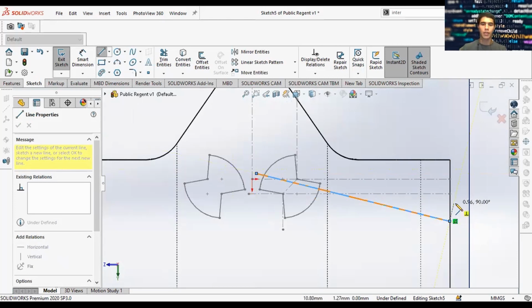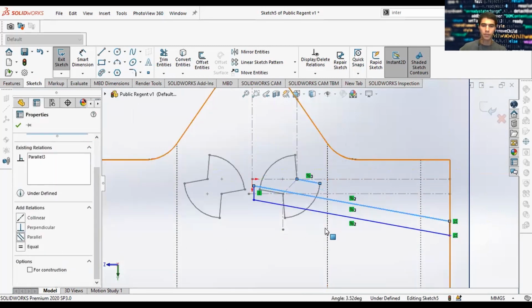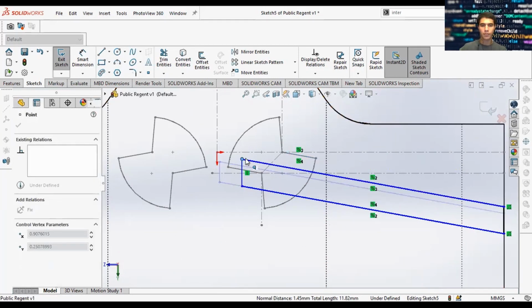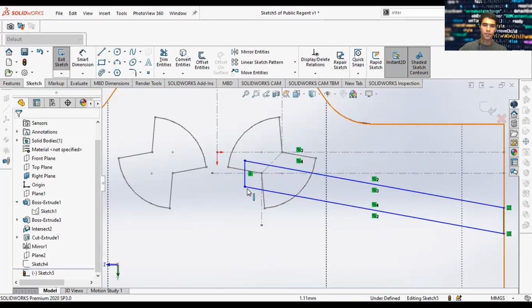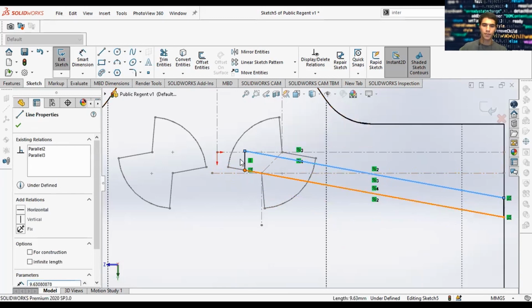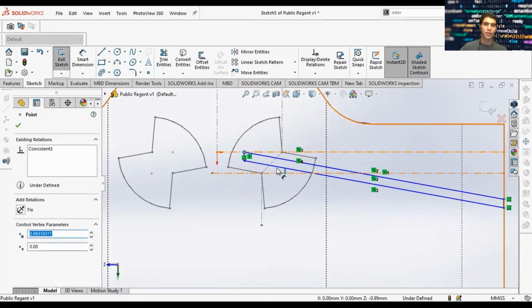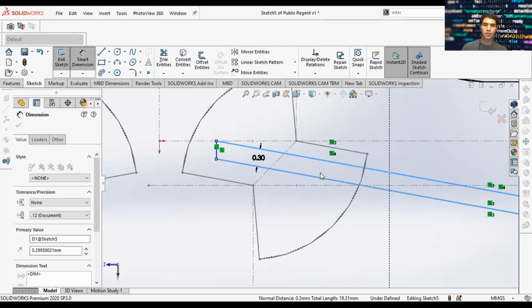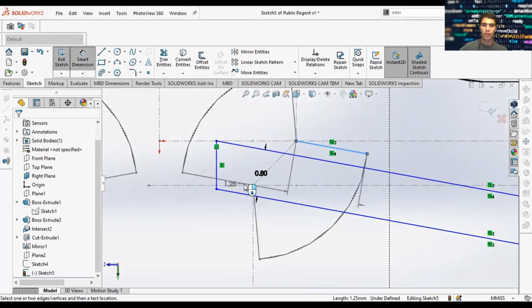And we want our leaflet design to be parallel to the angles that we put on for the hinge. So we will just select these two lines to make them parallel to each other. And then make this line parallel to this line. Let's give them an offset to this, or a thickness. Let's make this 0.8 thick.